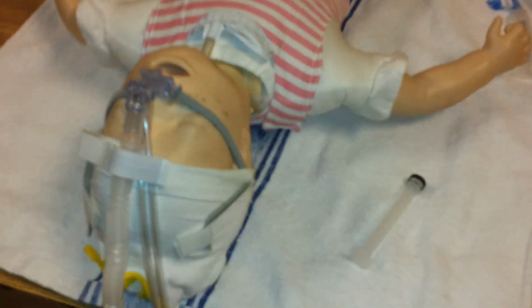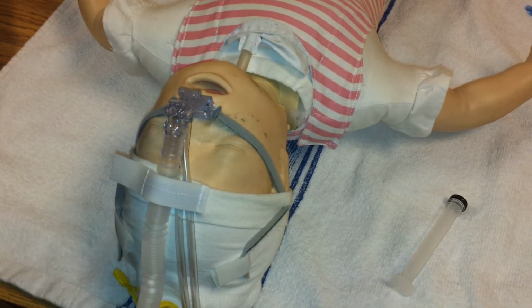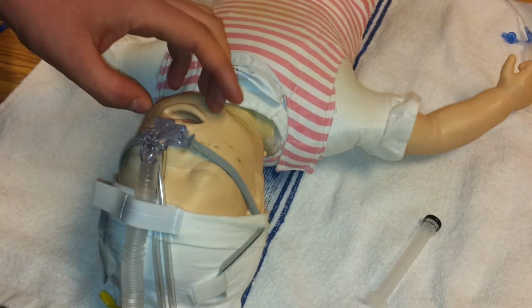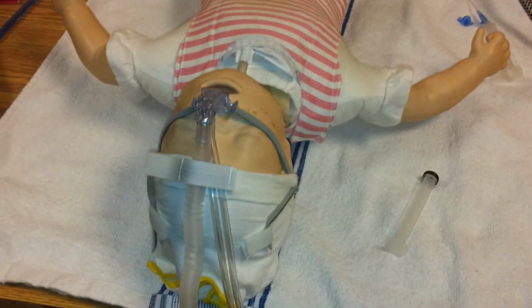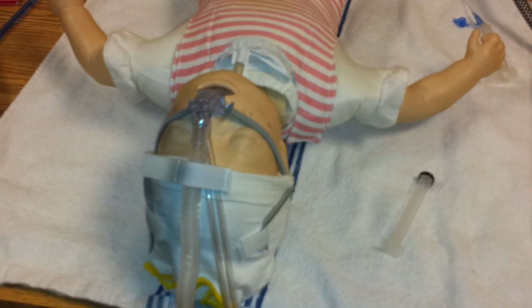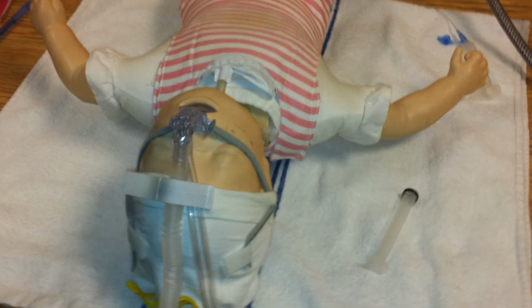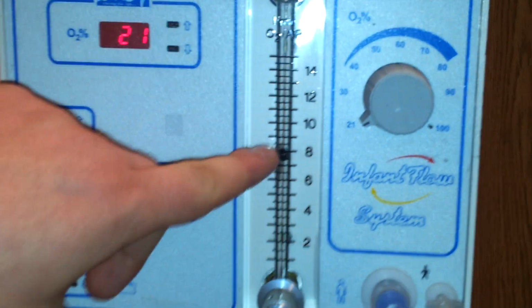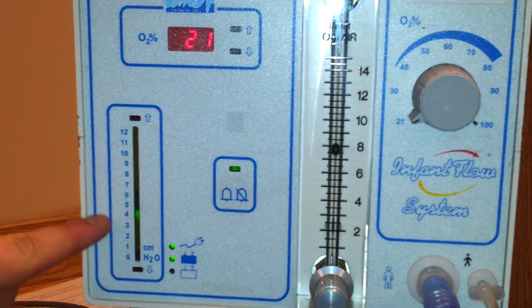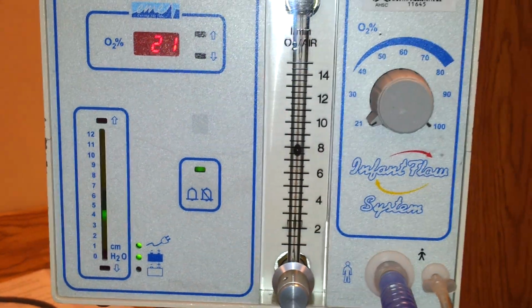Before you set this up, you always want to verify the doctor's orders and get all the equipment ready. Usually someone's providing the baby with some sort of blow-by oxygen or a PEEP with a flow-inflating bag or anything really. You want to aim for physiologic PEEP to start. So if you get a flow of 8, it should give you 4 to 5, which is what we have set up now. You can see the flow is at 8 and the PEEP is at 4 right now. So that's pretty much where you want to start.